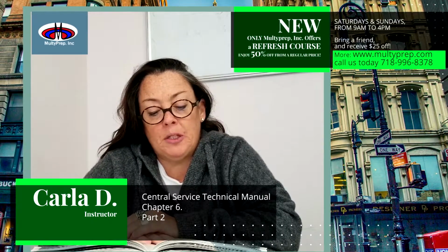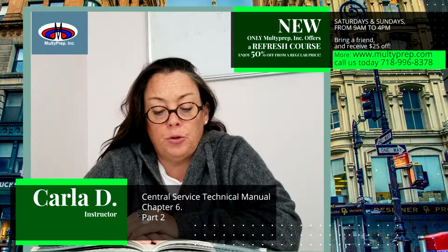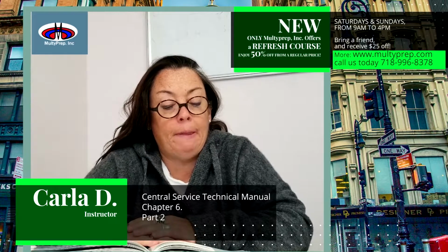Dress code requirements may change as CS technicians move from one area to another. For example, surgical scrubs and hair coverings may be appropriate for the clean assembly area, but OSHA required PPE is necessary for the decontamination area. See Figure 6.9 as an example.